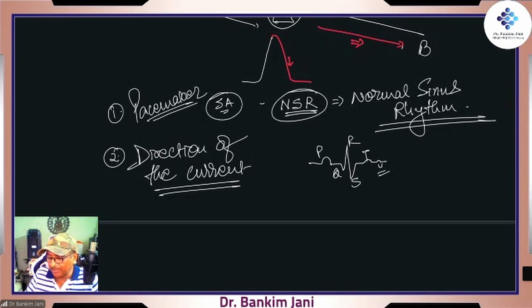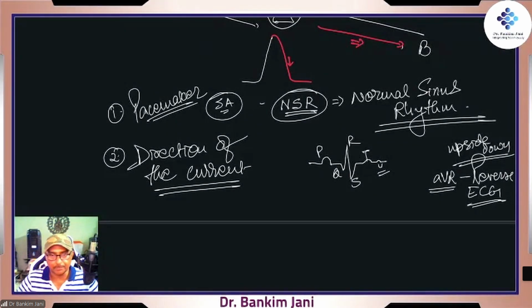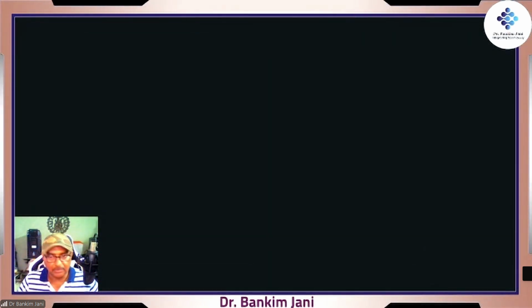But one thing is very clear, that in aVR, the appearance would be totally reverse. Correct? In aVR, it would be the complete reverse ECG. Right? Upside down. I'll write it upside down. And you know the reason also. And in case you don't, it will be even more clear as we discuss it today. So far, all good.